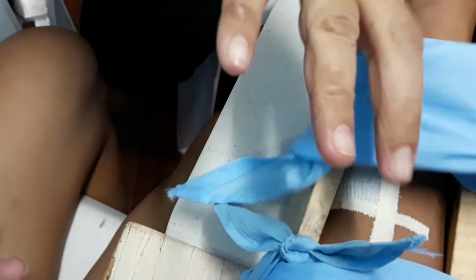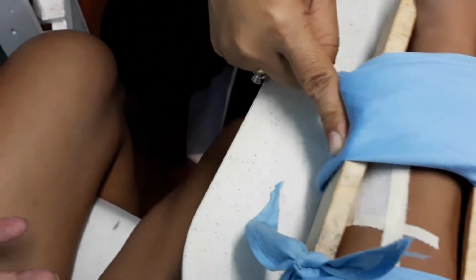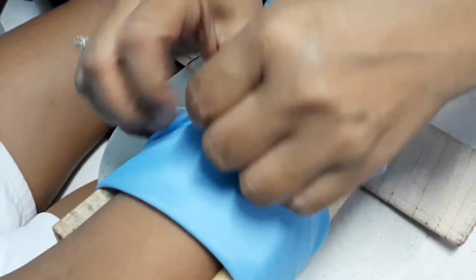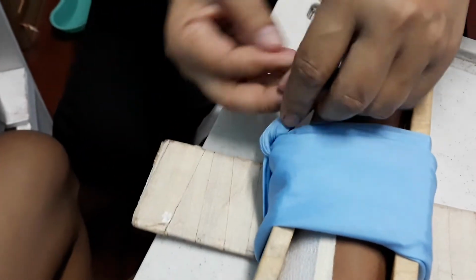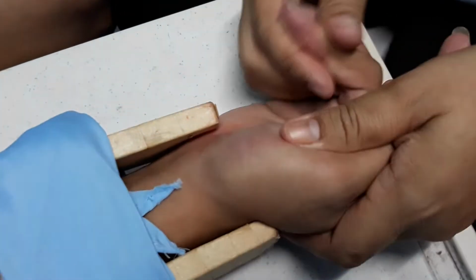Remember, the reason for your bandage is for aesthetics. It has an aesthetic reason. You have to keep it that way. One over the other and always over the other, like that. And you have to insert now your bandage to maintain its aesthetic purpose. Okay, like that. And of course, you have to check if your bandage is not too loose or not too tight.